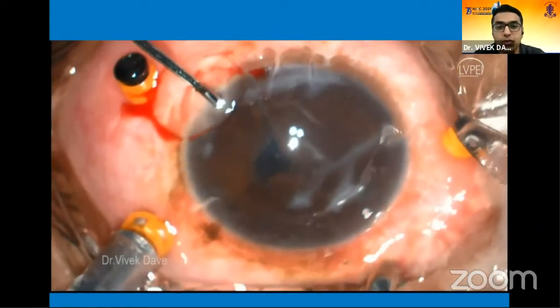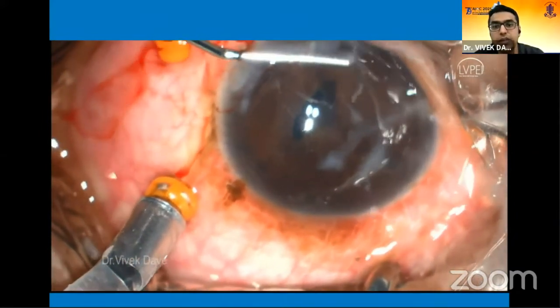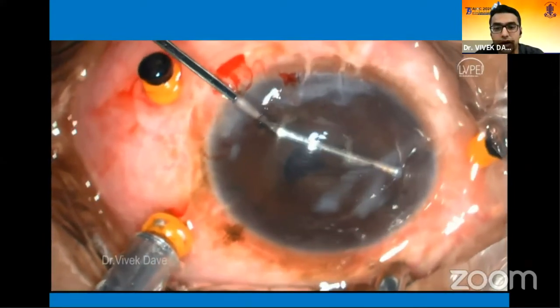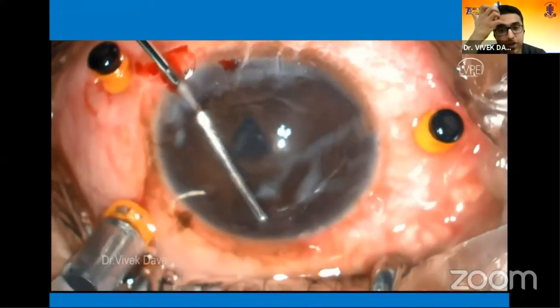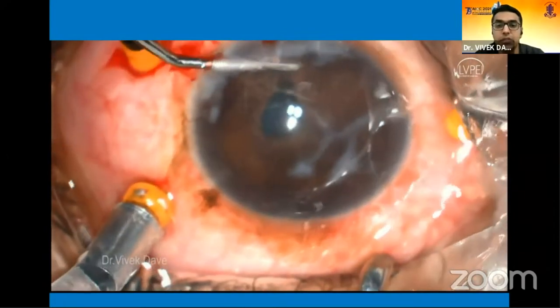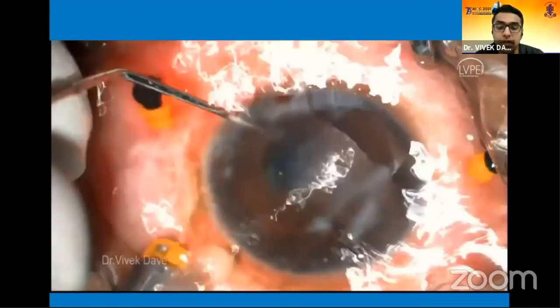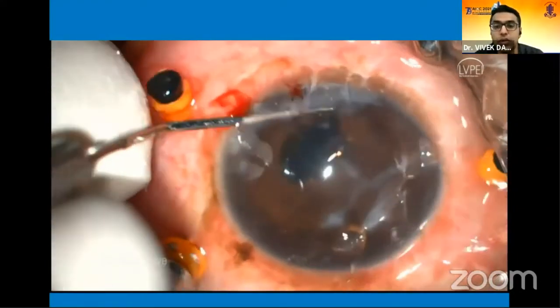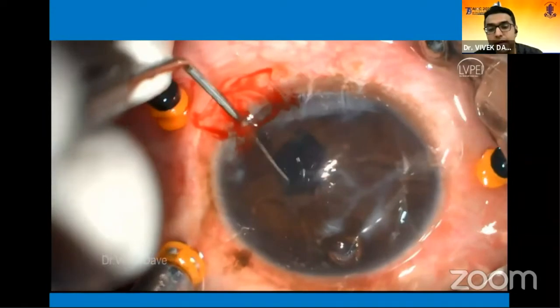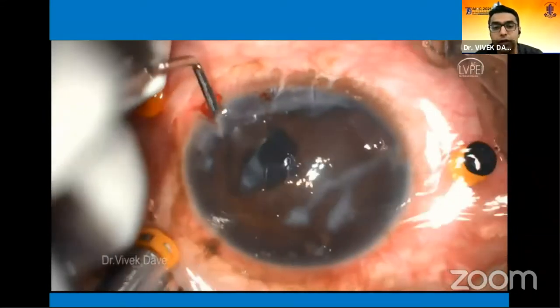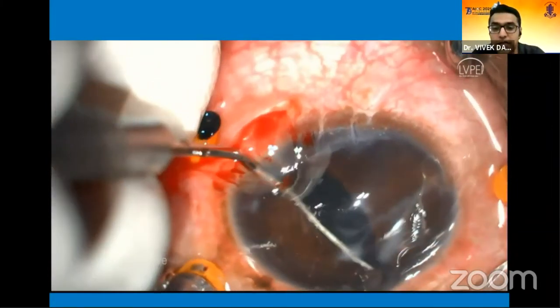First we had to tackle the anterior chamber. I'm filling the anterior chamber with viscoelastic and doing a visco-dissection between the iris and the corneal endothelium to enlarge the anterior chamber space. The pressure transmitted back on the iris cyst — because the cyst is taut — can cause it to collapse. This may give a false sense of security that the cyst has been released, whereas it has only collapsed.